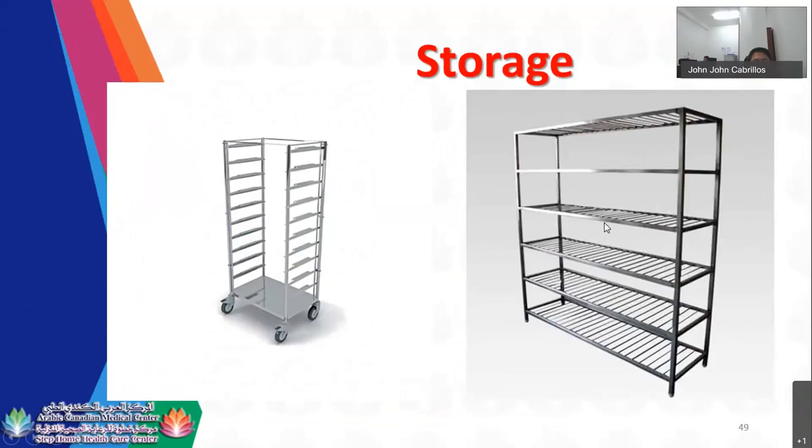So this is a sample of your storage shelf in CSSD. Ideally, for this lower part, it should be solid, the same as this one. Okay, it should be solid. If ever your bottom part is not solid, then you can put a shelf liner. The reason why it should be solid is because you need to protect the instruments or packages from contamination when cleaning the environment, especially on the floor. Okay, so it should have a shelf liner. If this one is not possible, this is the idea.